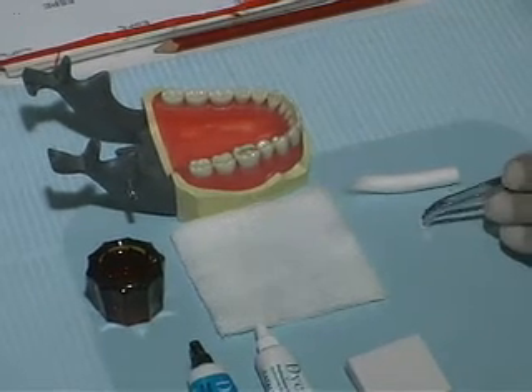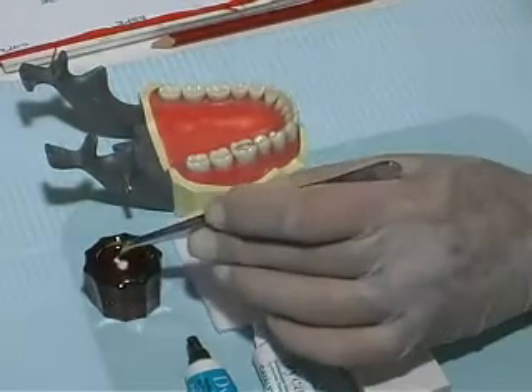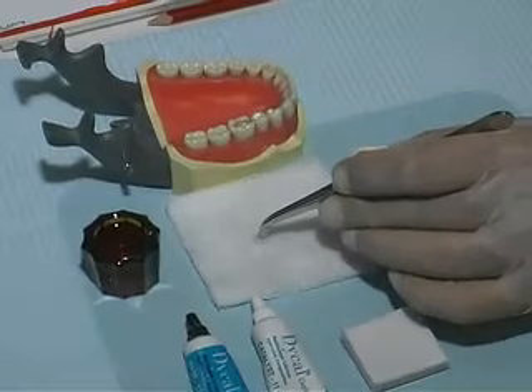Using the cotton pliers, pick up a small cotton pellet, wet it, and remove the excess water by squeezing it on the gauze. Place the damp cotton in the prepared cavity.